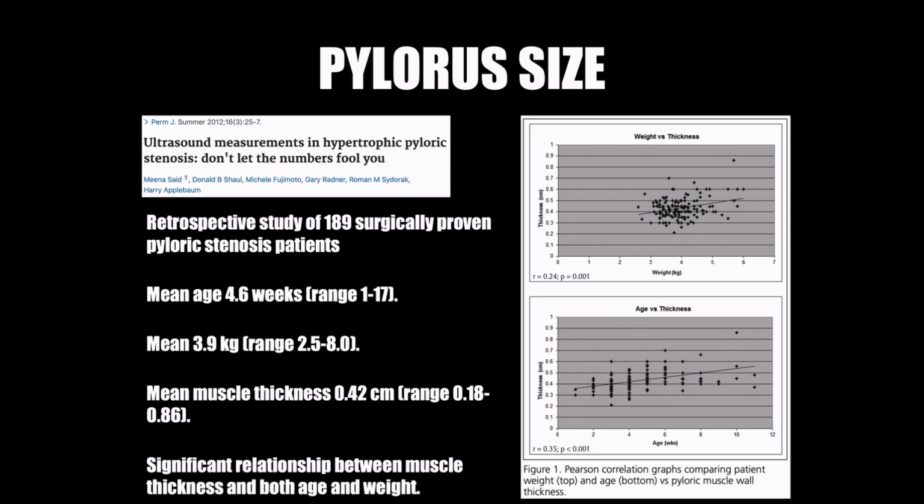But if you have a patient where that is getting close, you may want to consider repeating your evaluation a little bit just to make sure that it's not persistently maintaining that enlarged size, and you know that you're not on one of these borderline cutoff cases, because if it's pylorospasm, it should relax eventually, whereas if it's pyloric stenosis, that muscle is not going to get any thinner.